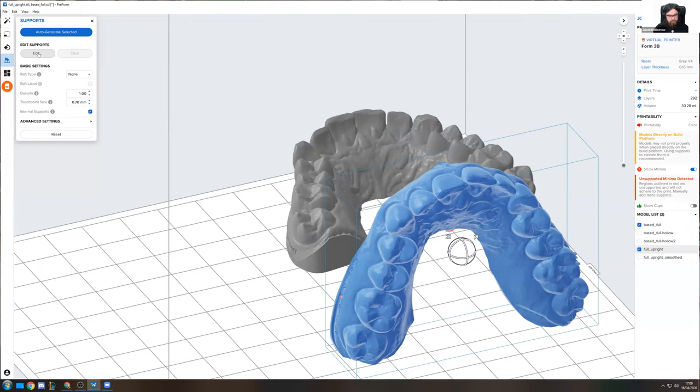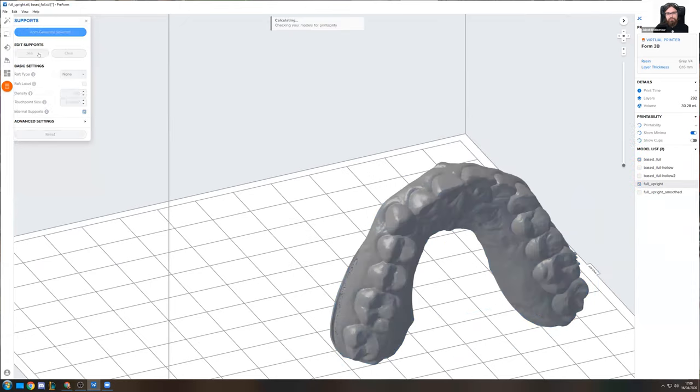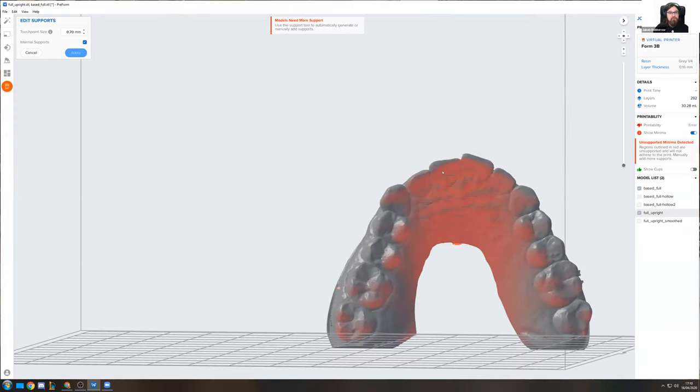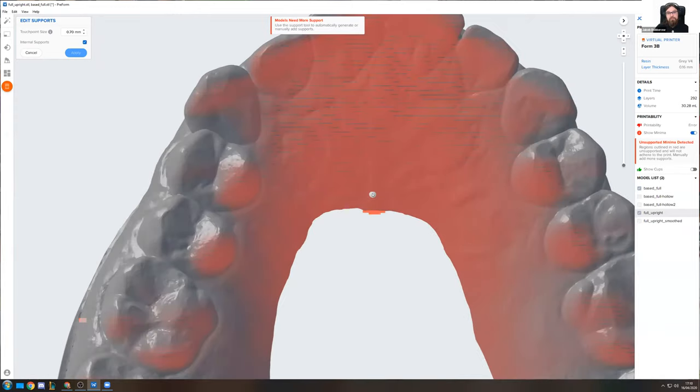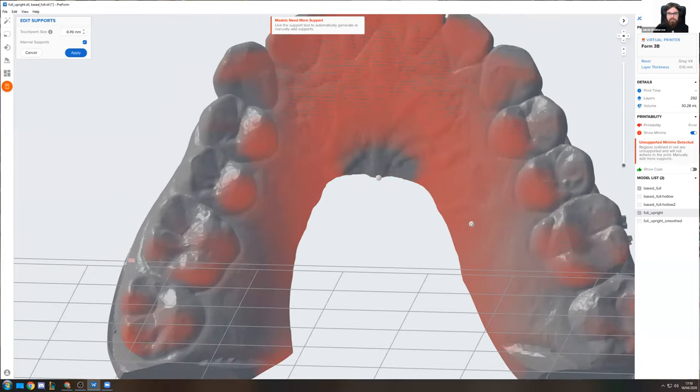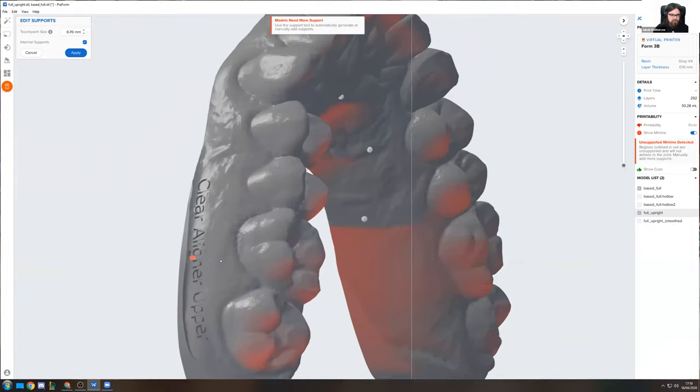And then you can go into the support edit mode. You don't have to clear out all the supports first. You can do this while having the supports be generated at first. I can just go in here and set supports where I really do need them and where it's easy for me to take them off. I'm just pressing left click here to support these parts right there.